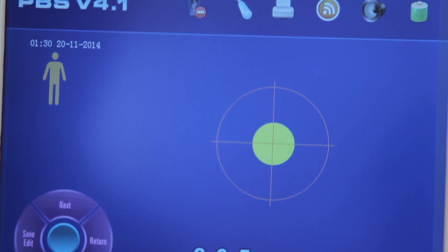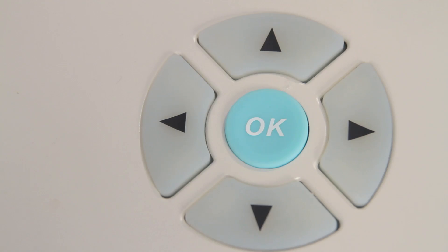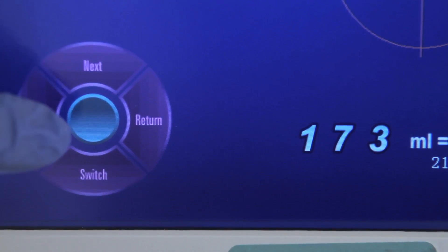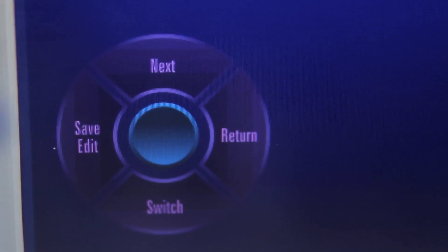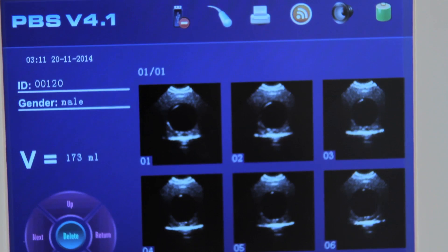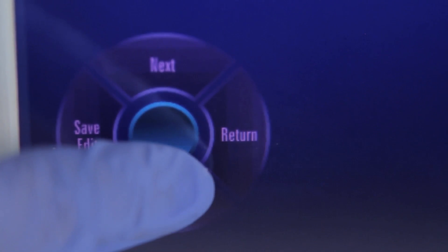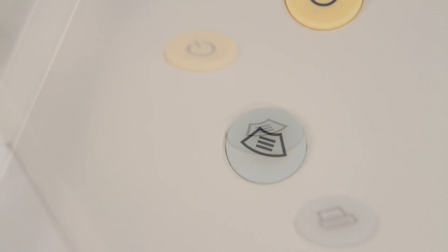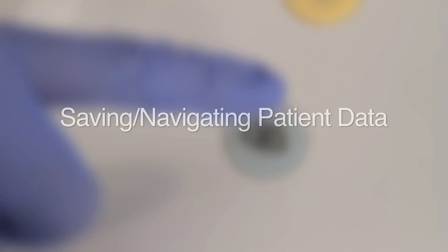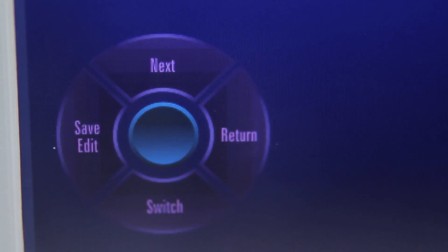The Scan Results screen displays the results of the scan. Press the right directional key or touch the Return functional key to return to the Ready screen. Press the left directional key or touch the Save/Edit functional key to enter the Save/Edit screen. Press the up directional key or touch the Next functional key to toggle between the scanned images. Press the down directional key or touch the Switch functional key to switch between grayscale and two-color images. Press the Printer key on the control panel to print the current images. Press the Scan key to return to the pre-scan screen and scan again.